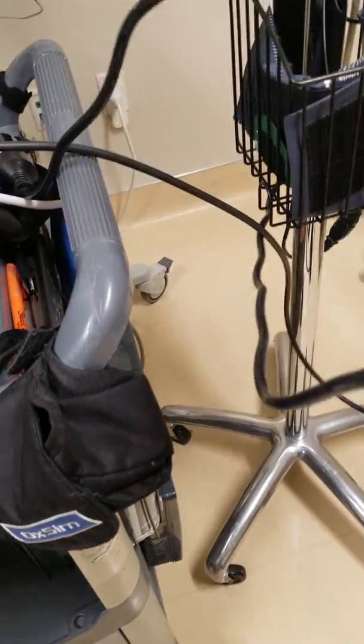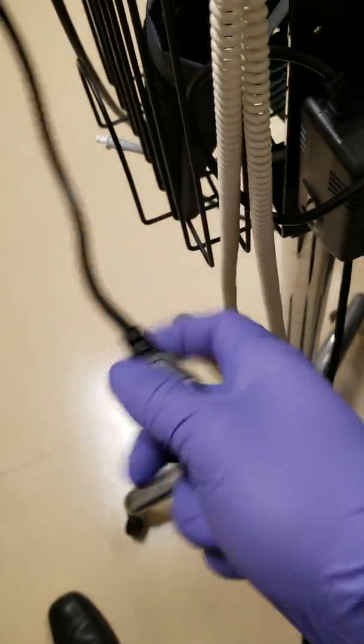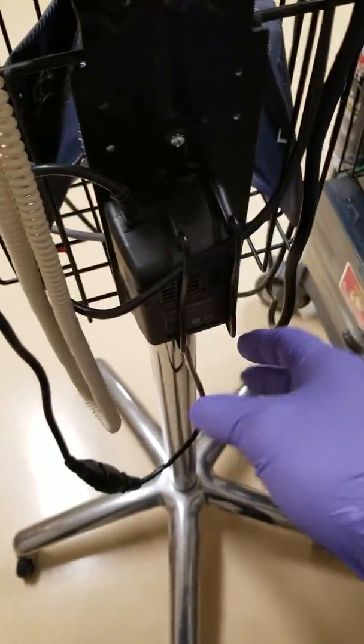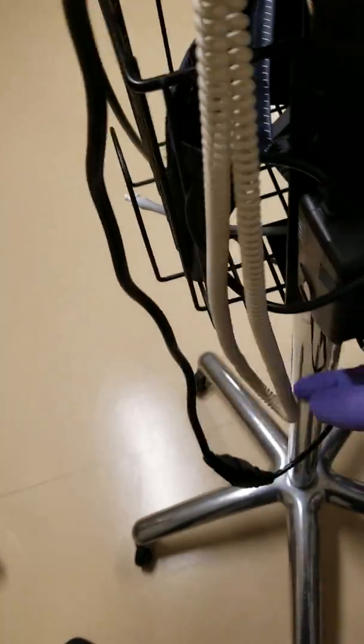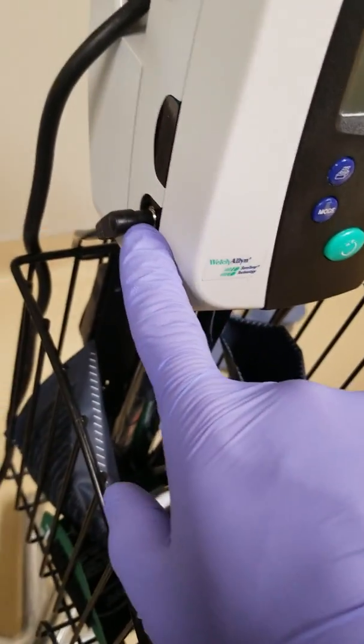The first thing we want to check is the power cord — the most common thing on every single piece of medical equipment. Run your hand through it to make sure there are no cuts and make sure it's plugged in to the outlet. We have our power supply here: 120V goes in, 12V comes out.